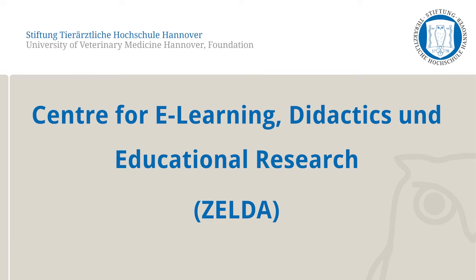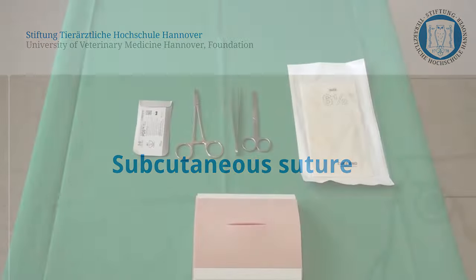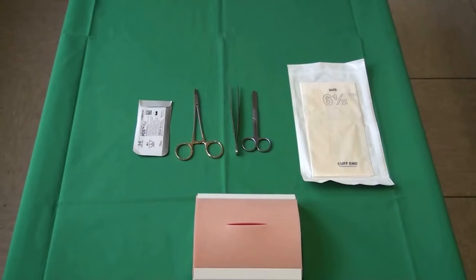In the following video, the Clinical Skills Lab of the University of Veterinary Medicine, Hanover will demonstrate the subcutaneous suture. This is a continuous suture, sewn with one thread. A needle and thread, gloves, a needle holder, tweezers, scissors, and a suture pad are required for this exercise.